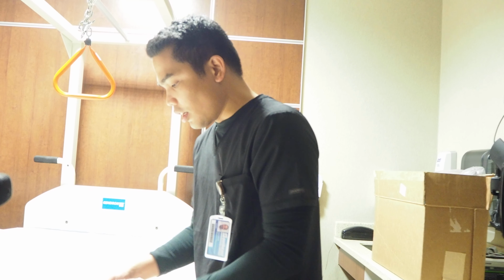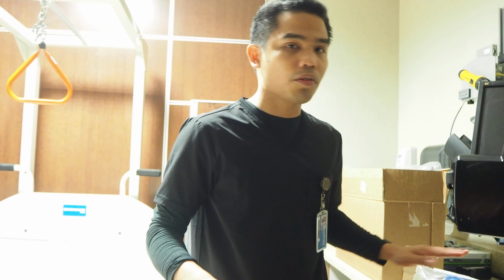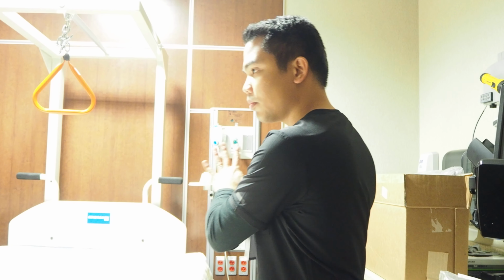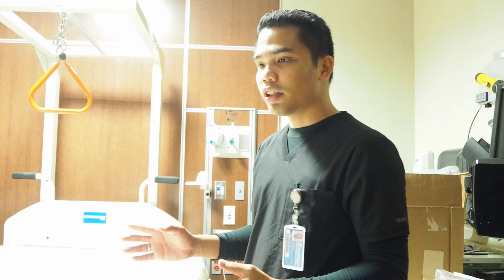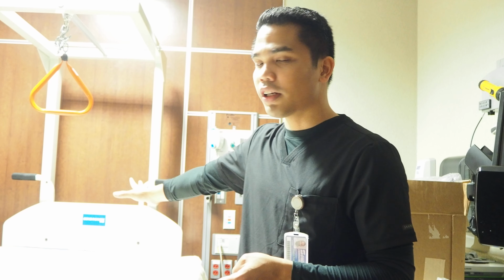And then another important thing for incentive spirometry is that we let the patient practice it every hour, especially during waking hours in the morning. And it is indicated for patients who are able to understand and able to cooperate. And also once everything's been done, always ensure, as I mentioned, to let the patient cough if they have secretions present, and always re-auscultate afterward, and then obtain any vital signs.